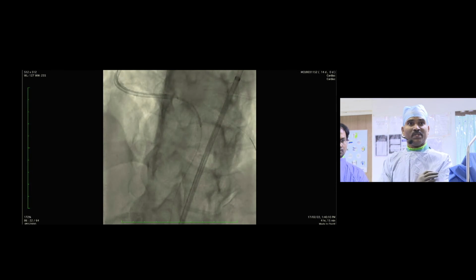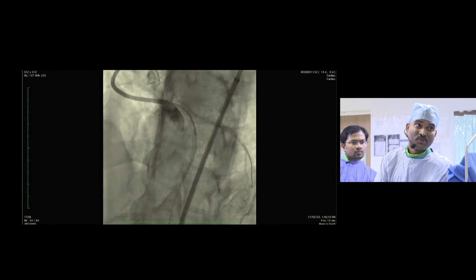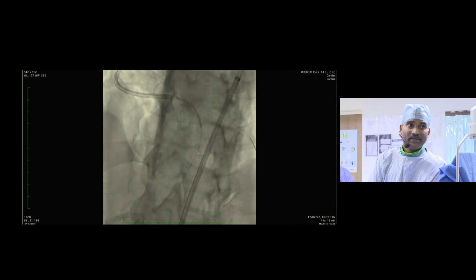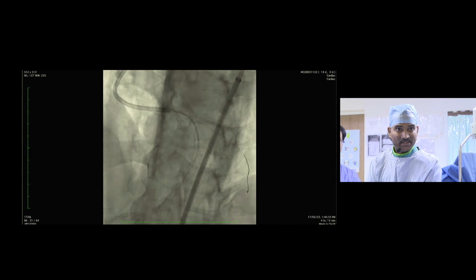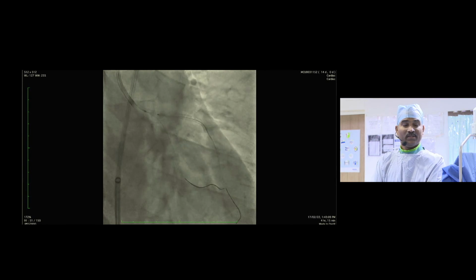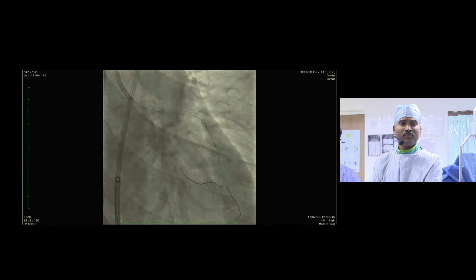So this is a proximal stent which we took, and we are stenting from ostial LMCA. You can also see the subintimal hematoma. We have not injected because we already anticipated this issue, and we did the entire thing with only IVUS, 3.5 by 28. So we deployed from ostial LMCA next. We did a POT with, I think, a 4.25 balloon, as LMCA was around 4.2, 4.25.